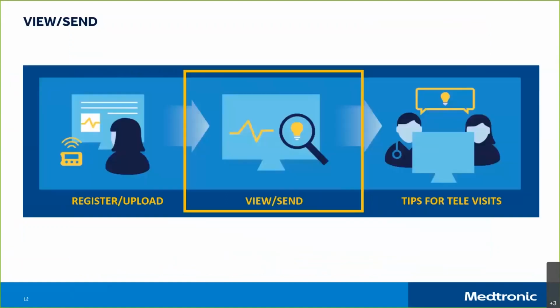I usually download my pump data a day before I go see my provider or a day before my televisit to make sure that I'm ready for the appointment. This is a great best practice, Cheryl.